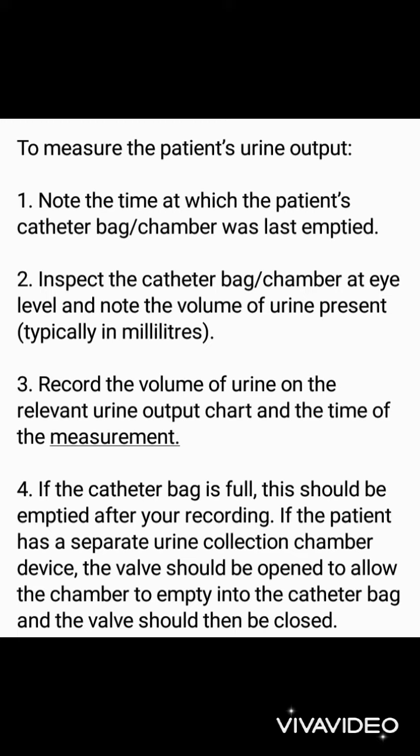If the patient has a separate urine collection chamber device, the valve should be opened to allow the chamber to empty into the catheter bag, and the valve should then be closed.